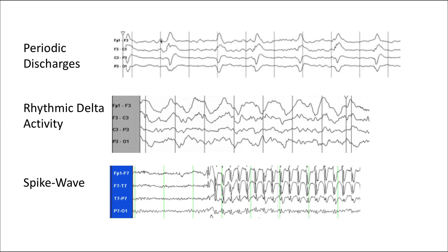With periodic discharges, you have a waveform followed by an inter-discharge interval, followed by the waveform, followed by the inter-discharge interval, and so on. The rhythmic delta activity in this example is continuous — there is no inter-discharge interval.